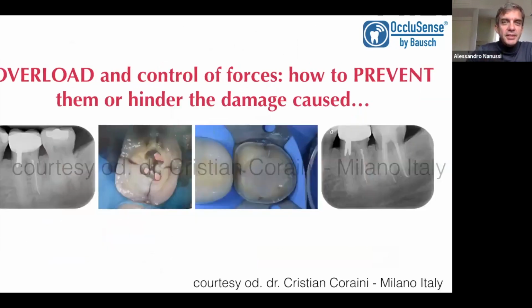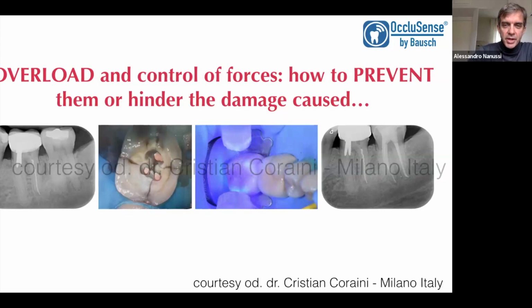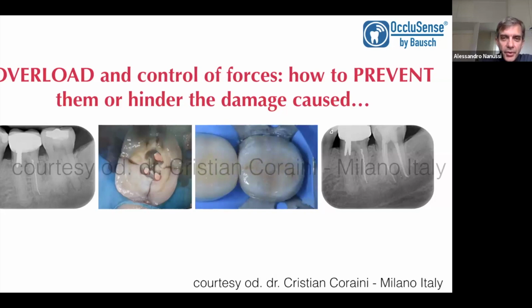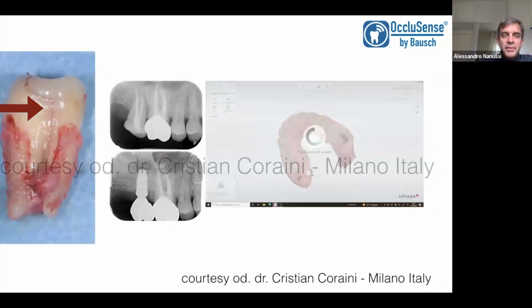Overload has to be managed by controlling forces, because sometimes we can have problems with forces. We need to prevent the damage that it causes. You can see here an example of a restoration with an onlay in composite, and sometimes our restoration cannot prevent the fracture of the tooth. We need to check how much force is on our tooth or on the rehabilitation, because an excess of load could create a crack in the root, and we lose our tooth and need to position a fixture, for example, as in this case.